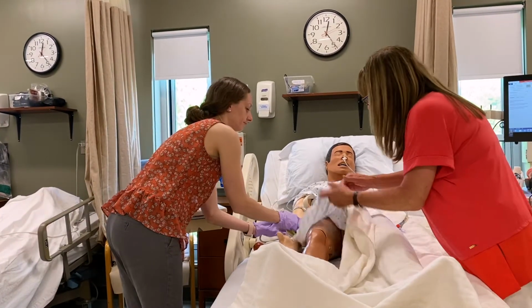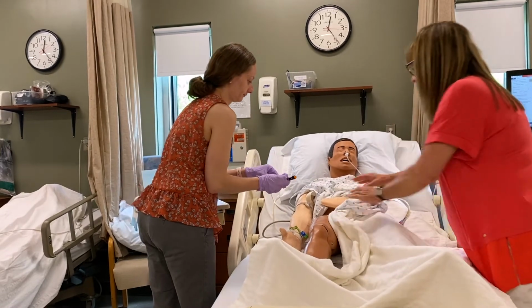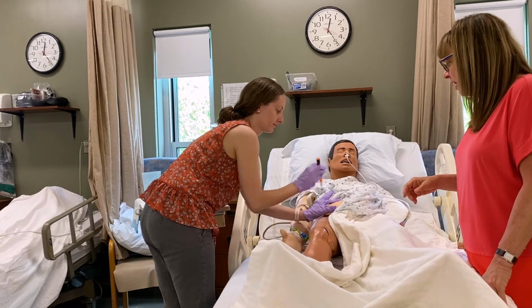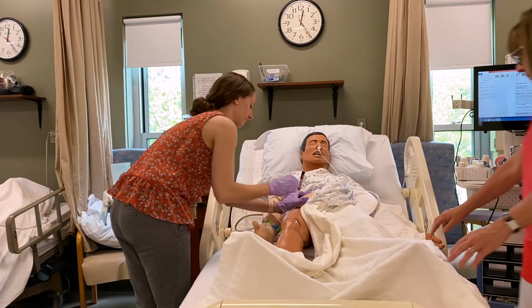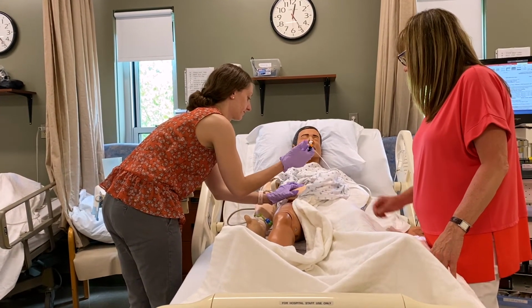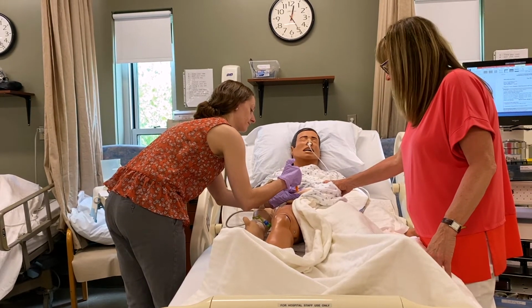And you can give this to them in the abdomen. And because of the density and the heaviness of the pen, you can use one hand with this. Pushing it in.